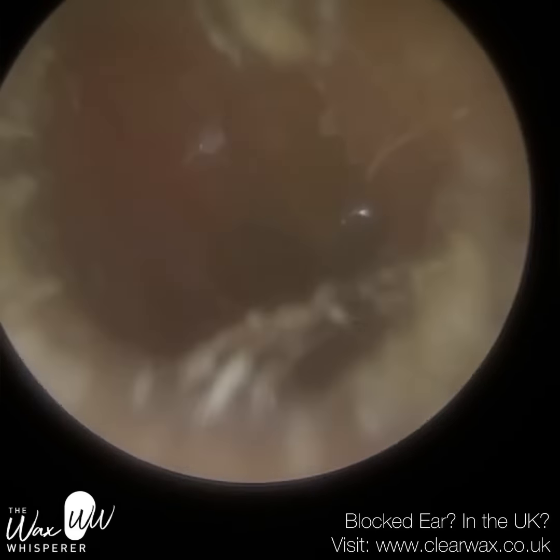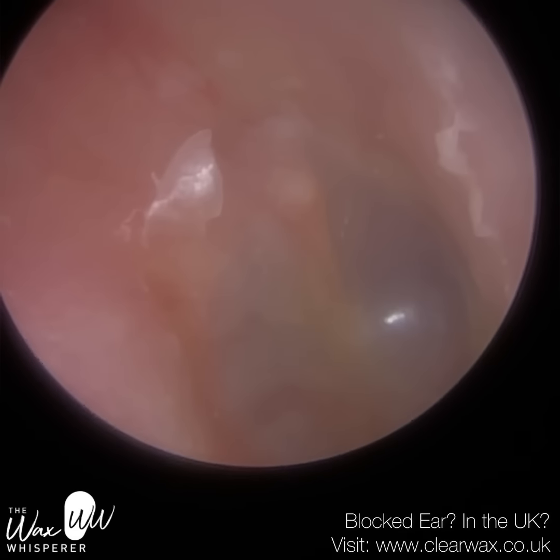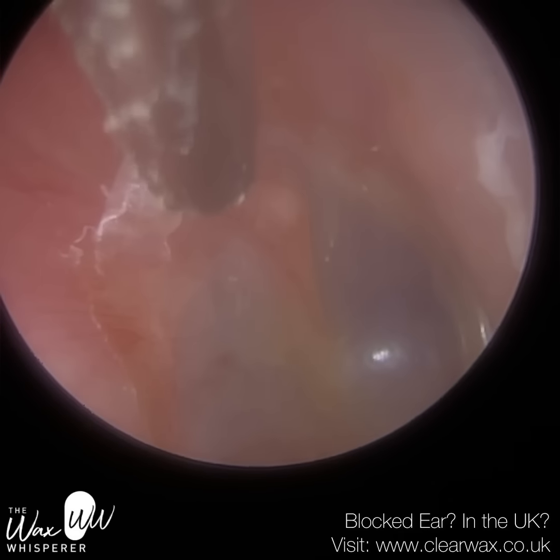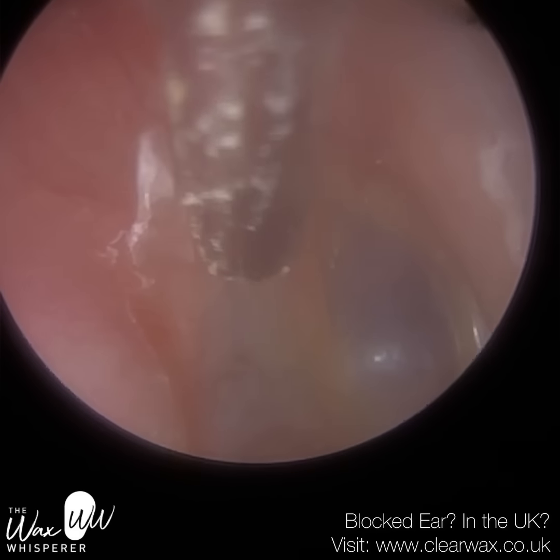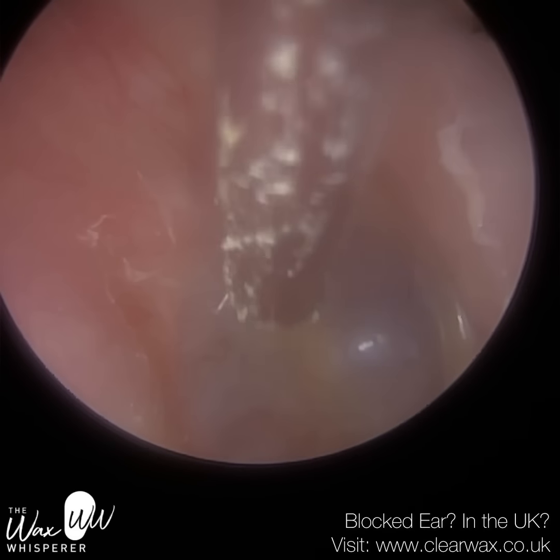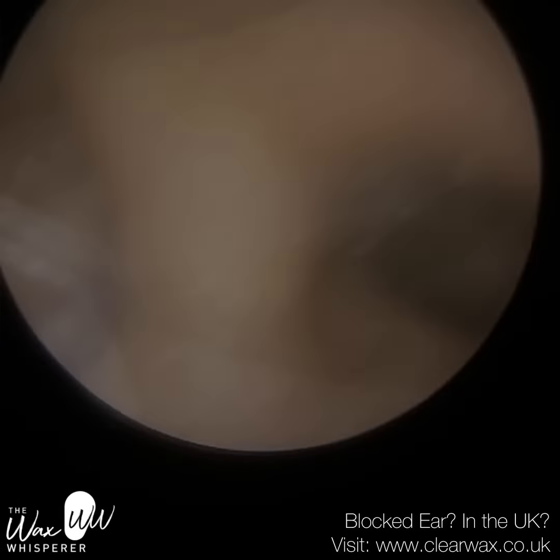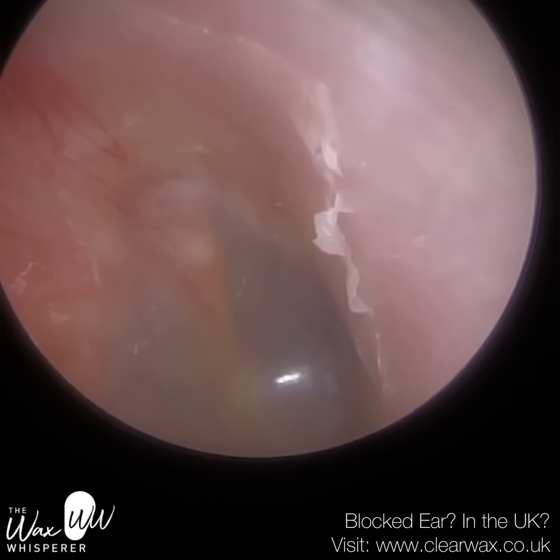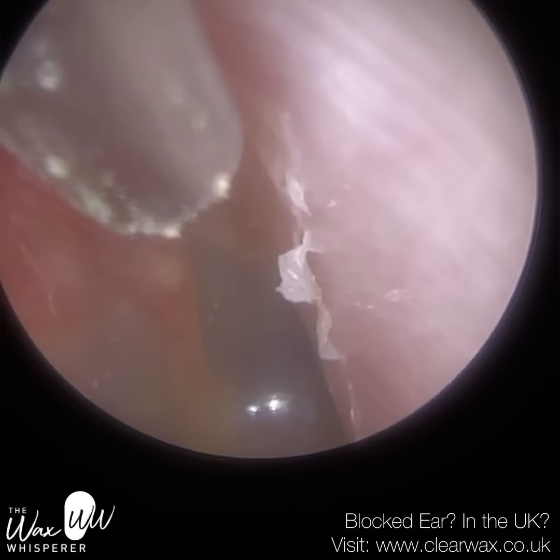It's just a tailing end of some skin there as I flaked away. So again, I'm going to see if I can get that. If I can't, fine. It's just not possible to get a really little piece without potentially causing trauma. If the patient's asleep, then yeah, we can basically do what we want to a certain extent. We can graze against the ear canal because they won't feel it whilst they're asleep. When they wake up, it might be a bit bruised though, so they may feel it afterwards.